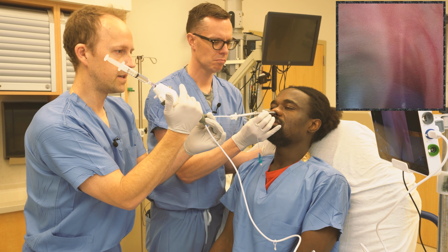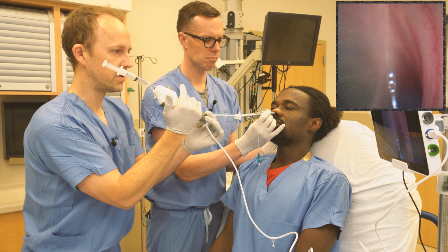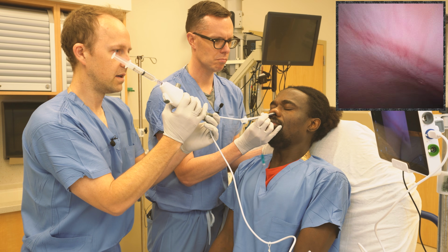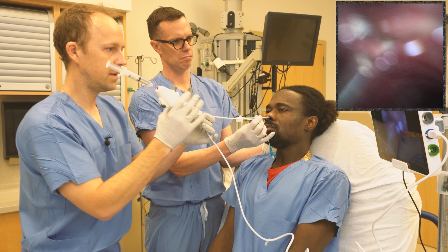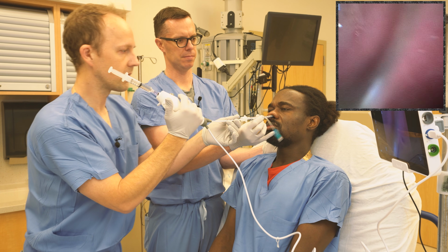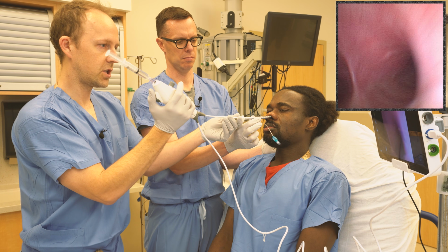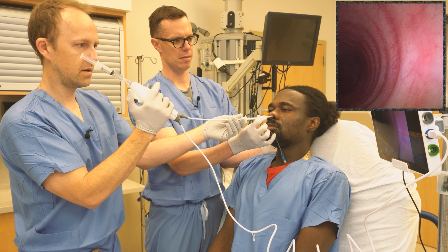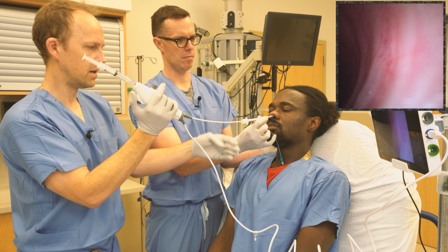And this will be to a depth of about 28 centimeters or so. But you can actually use your scope to assess. We go a little bit deeper there, and then we'll pull the scope up. Okay, we can check the depth of the tube. Actually, a little shallow still.